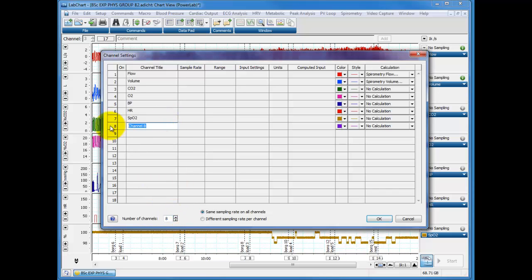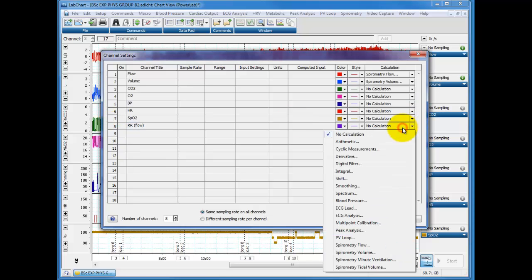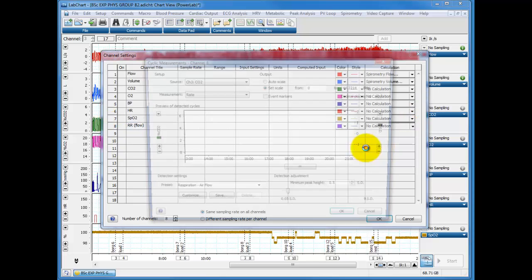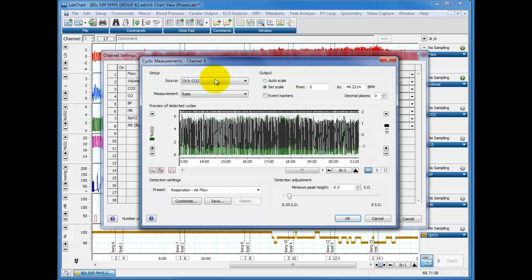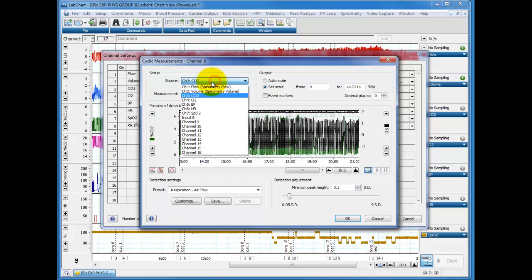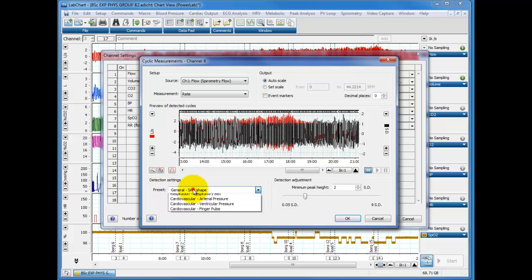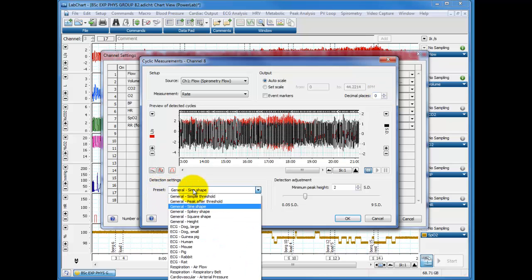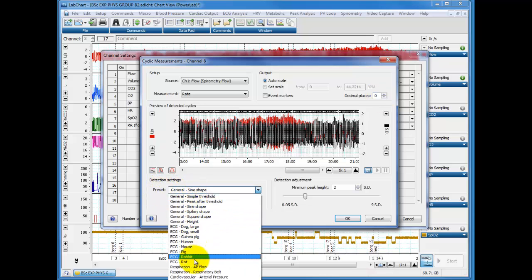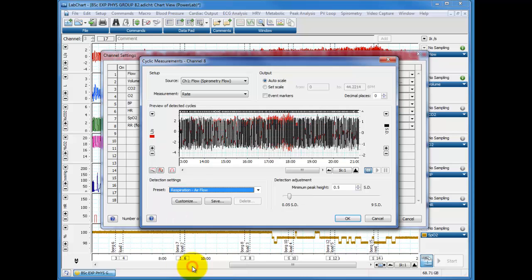And we'll call this one respiratory rate, RR, and this is derived from the flow. We click on the no calculation button and choose cyclic measurements and we choose flow as our source. Measurement is rate. Let's leave decimal places at zero. By default it will be four, but I've got my machine set up here so the default is zero.